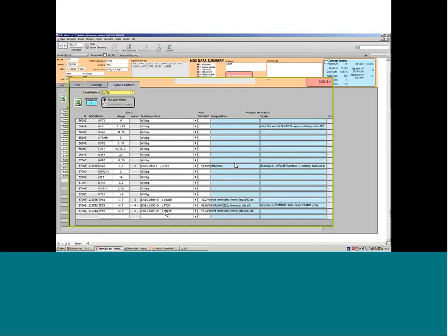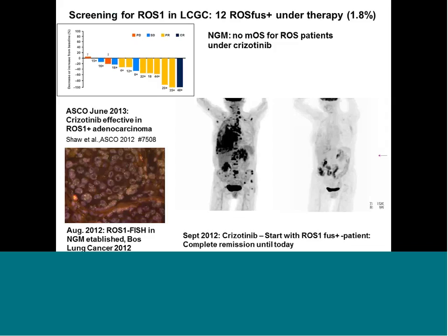storage, where all the histopathological data information is stored, and then it's annotated what genes have been sequenced, what is the modality of the gene? Is it activating the kinase? Is it inactivating? And what's the allele frequency? And is there a study available that would be a perfect study for this specific genotype and disease? So the bioinformatic pipeline is actually very important to handle this massive number of sequences from a large number of patients.